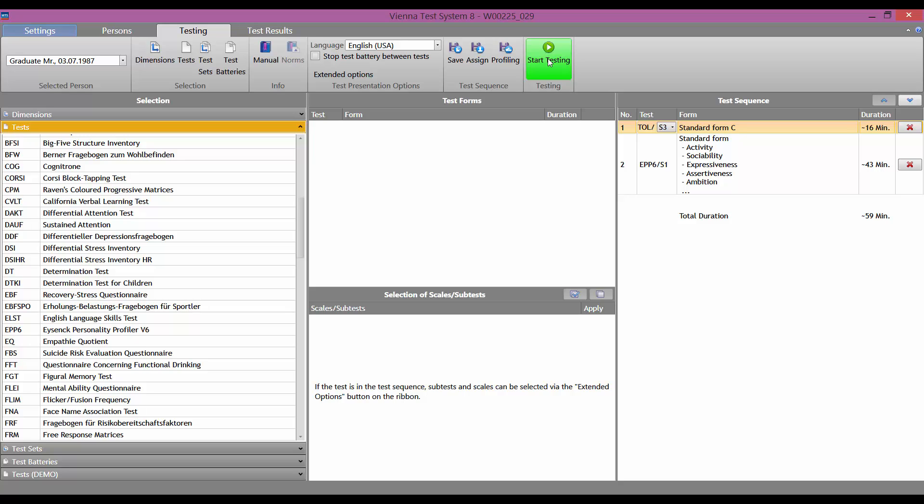If you want to compile a test battery, add the required tests to the test sequence column on the right, one by one.